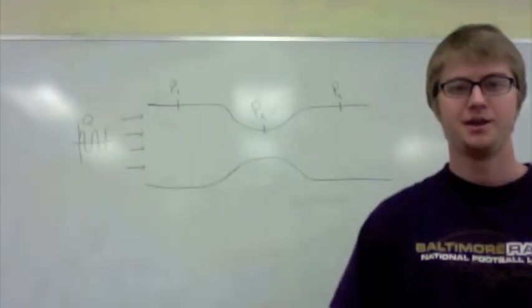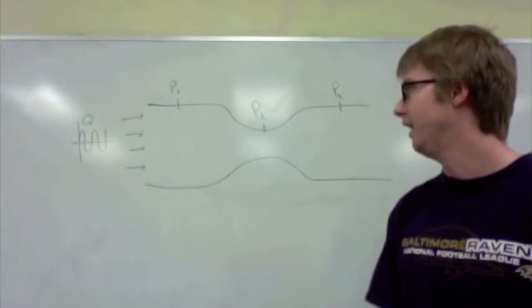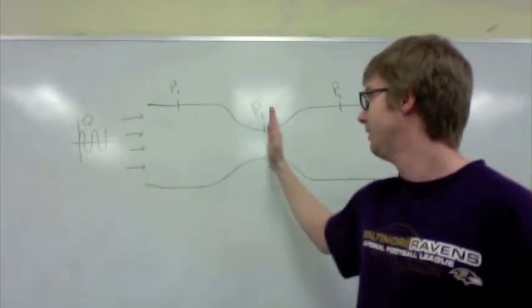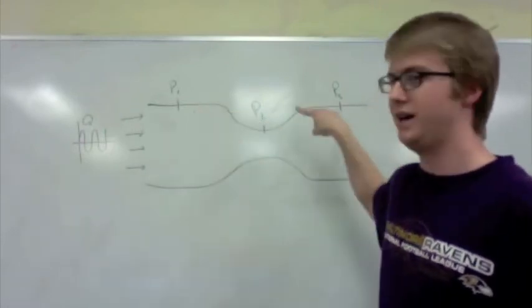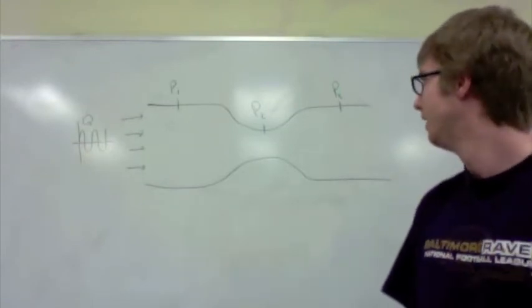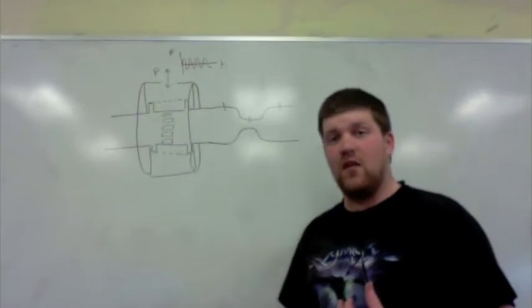So this is how our device measures flow rate. This diagram here represents the critical contraction of our device, and if you have a flow coming in from this side here, we're going to be measuring the pressure at 3 locations: upstream, at the throat, and the downstream. And by having the pressure difference between the upstream and the throat and the downstream and the throat, using an algorithm developed by a PhD student in Health and Science Research Facility, we can compute the flow rate through this tube.